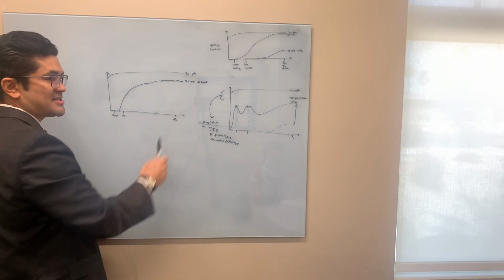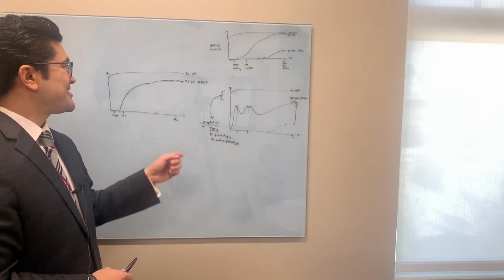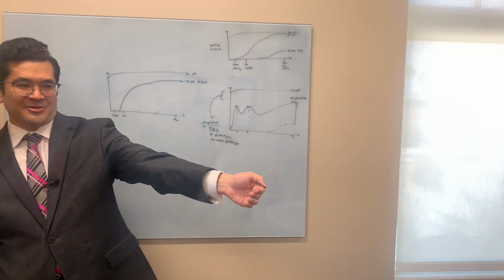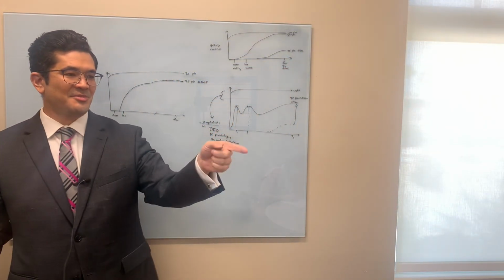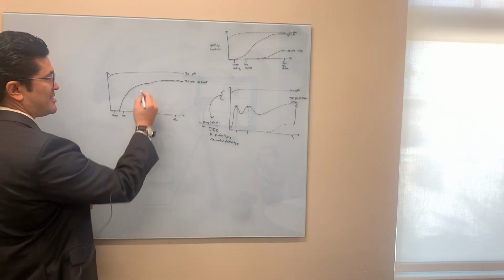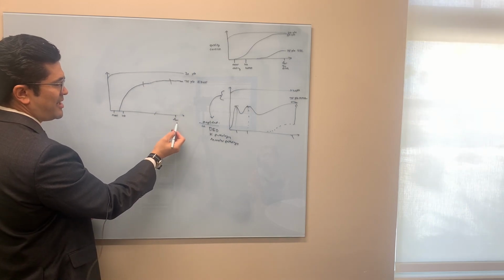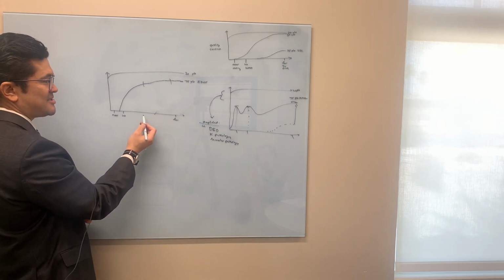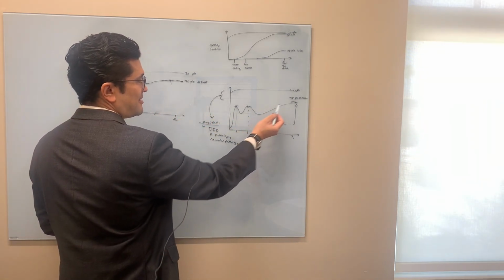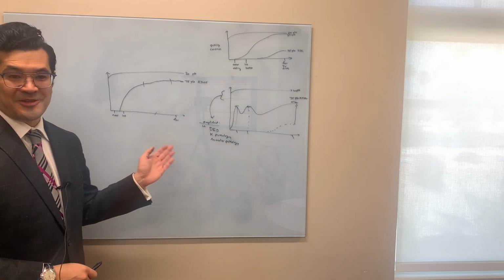The other people who like this, like we have some of our card dealers at the casinos here, they like the EDOF lenses because they can see their cards if they hold it far enough, but they also can see the person at a longer table. So this is the range where I think the Vivity patient is going to love it. So you're talking not quite 20 feet away, but more that 10 feet, 6 feet range. They do better. It's a little better curve. This drops off in that section. Hopefully that makes sense in the lenses.